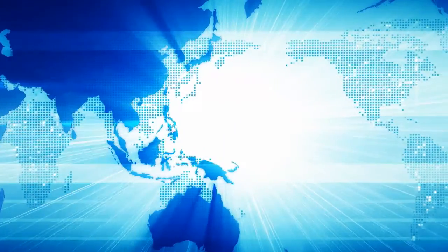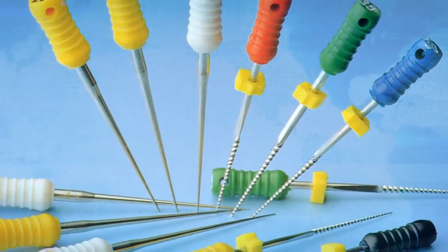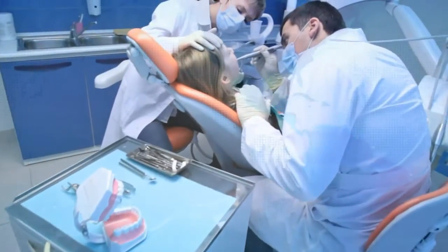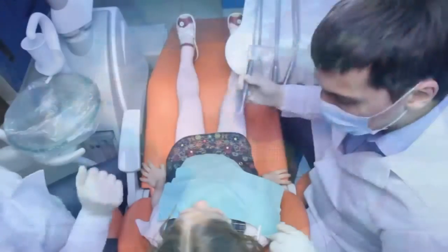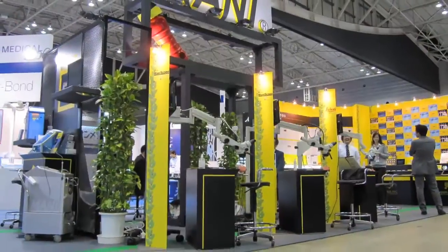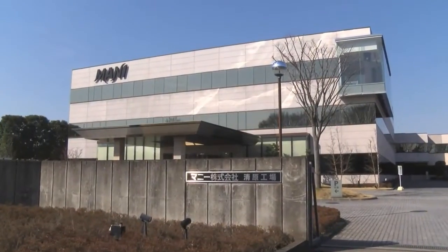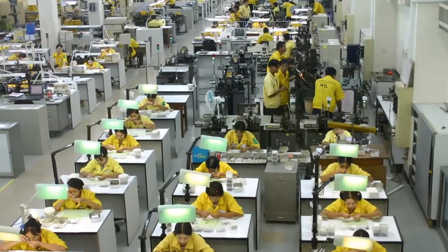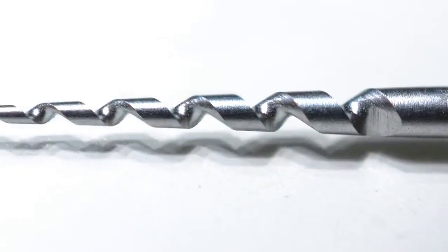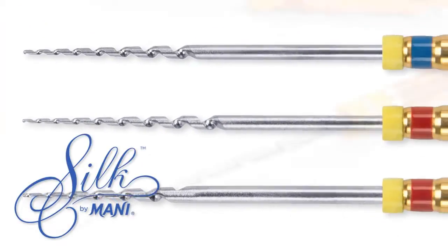Across the globe, the introduction of nickel-titanium instrumentation into endodontics has made canal shaping more safe, predictable, and clinically effective for both the specialist and general dentist. In a crowded marketplace, choosing from among the many available options can be challenging. Mani of Japan has made the choice much simpler with the introduction of the new and novel Mani Silk Nickel-Titanium Instrumentation System.